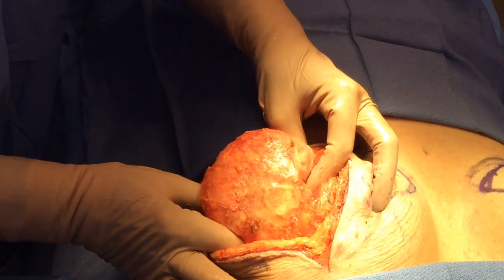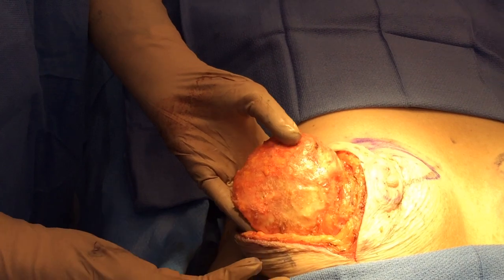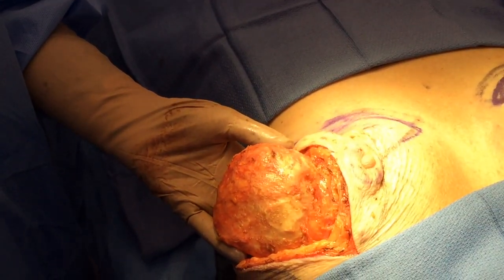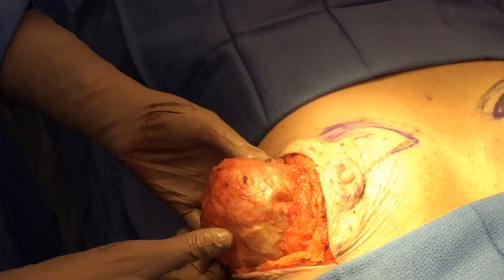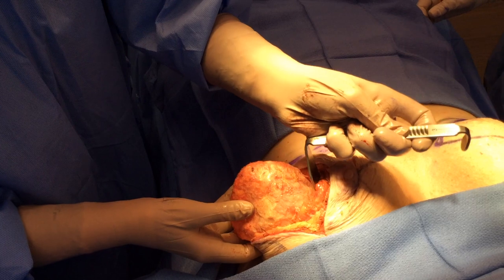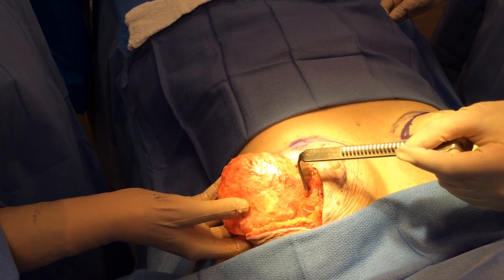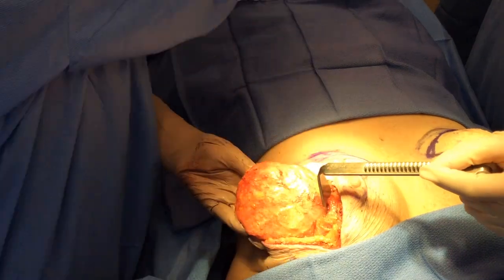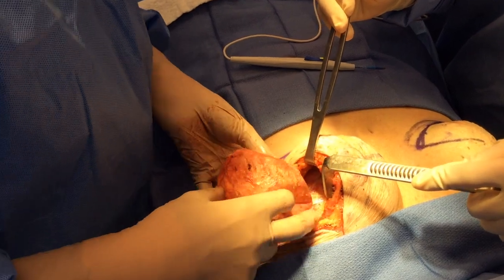What you're seeing here is the implant with just capsule. One of the things I think surgeons struggle with is they sometimes take breast tissue with the capsule, and that's not a great idea because it leaves the patient not looking so great and not having the volume that they could have. I just wanted to show you the end of this dissection. Going through my incision for my lift I think is really clever to do — I've been doing it now for a while — and I have my great helpers here in the operating room that make my job so easy.